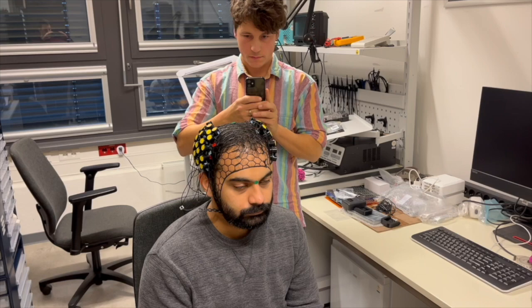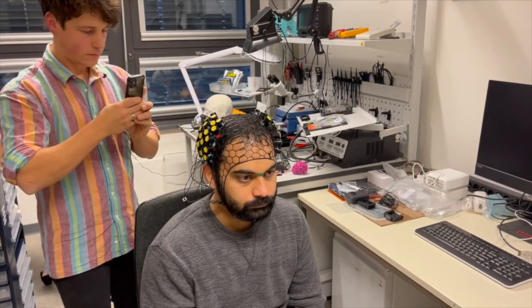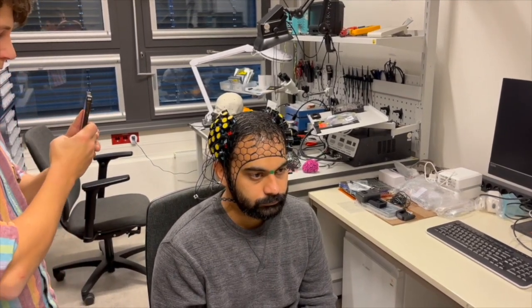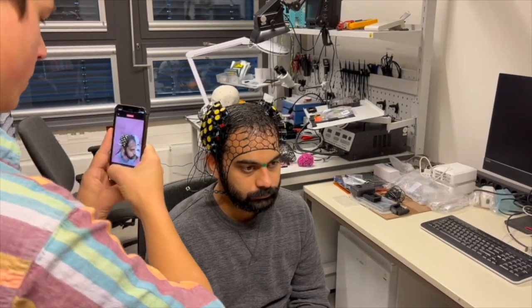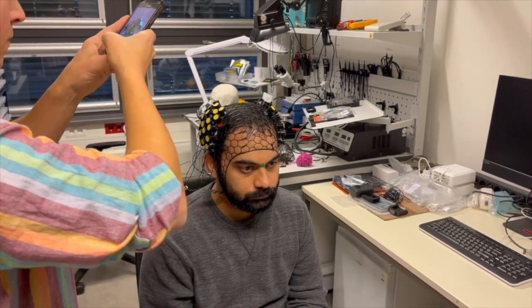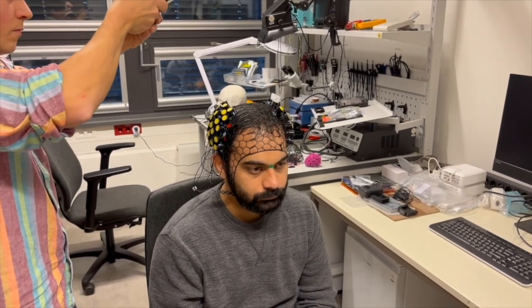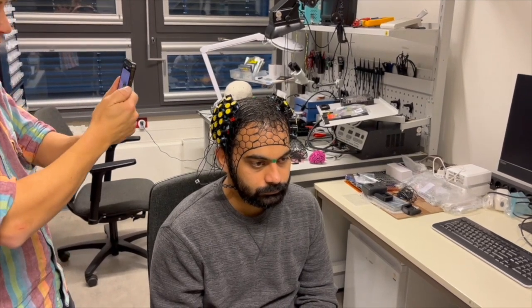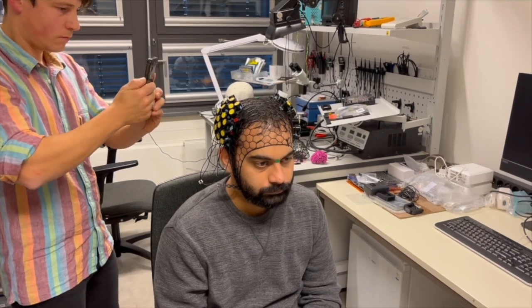Regarding resolution, that's a bit difficult to tell. It depends on hard and software solutions. Generally, I recommend not to use smartphones older than 5 years. And in case of iOS, if you have true depth function, this improves scanning resolution. I, for example, saw some papers out there reporting accuracies of around 2 to 5 millimeters. And the newer iPhones even have LiDAR, so using this, we expect to have a better accuracy also here. But again, we cannot really report any numbers here.